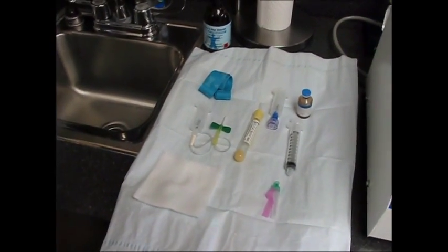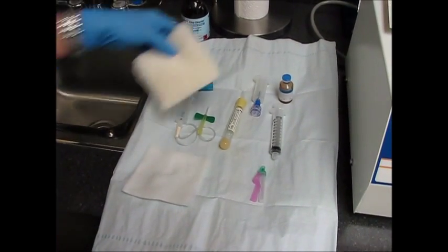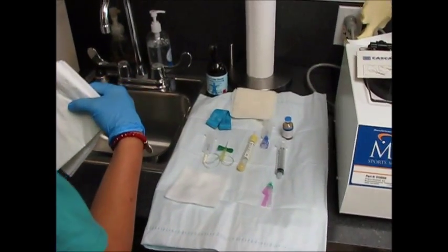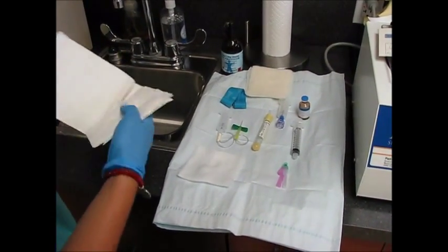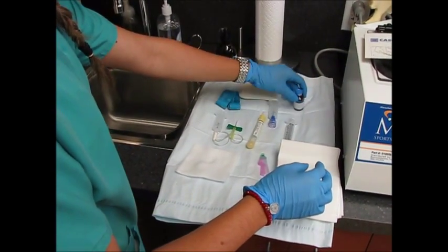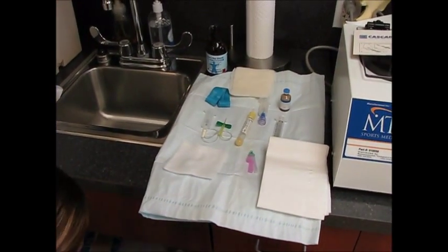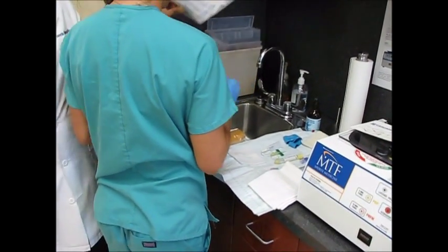We're setting up for platelet rich plasma here in Dr. Callback's office. He's going to inject it into a knee to facilitate healing — specifically for the medial collateral ligament, though it can be put in tendons as well.